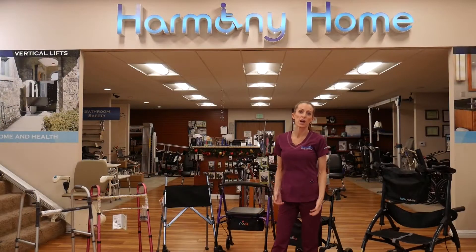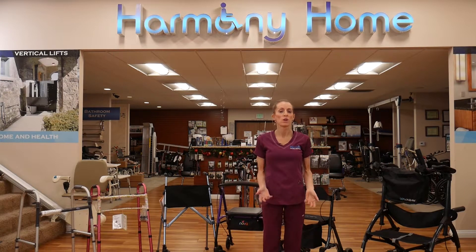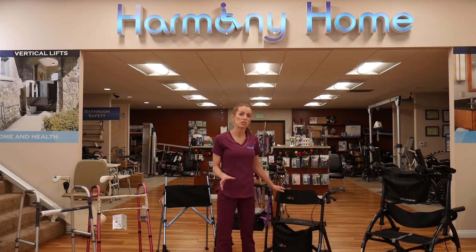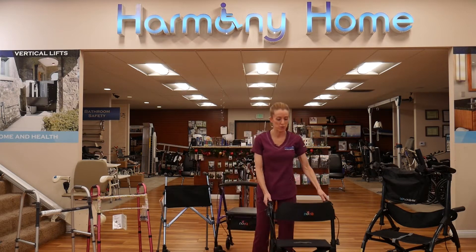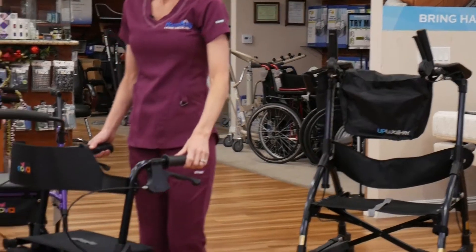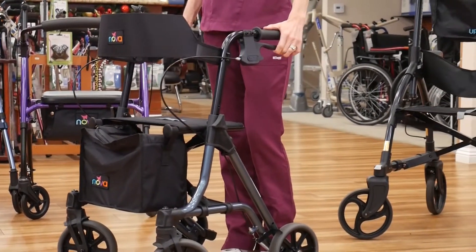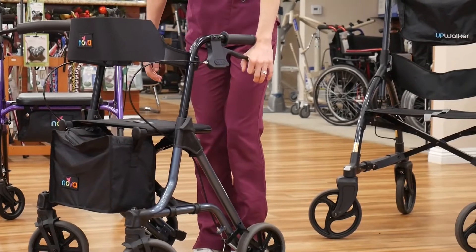We're going to go into how we use some of these items, with the rollator for instance. This is one of our most common rental items, and it's also available for purchase. It's the item I see most often in the world being used by people in the facilities that we visit.